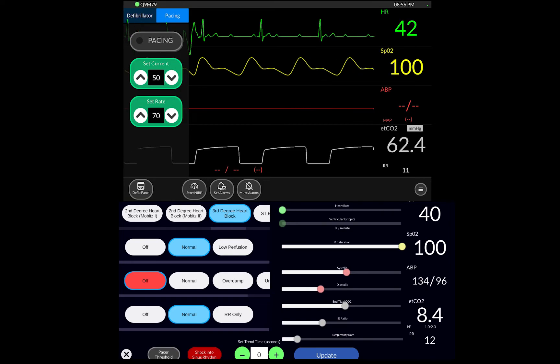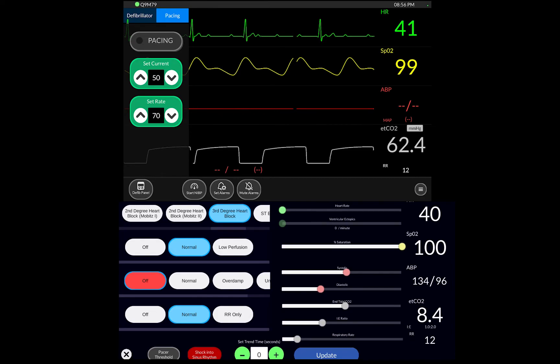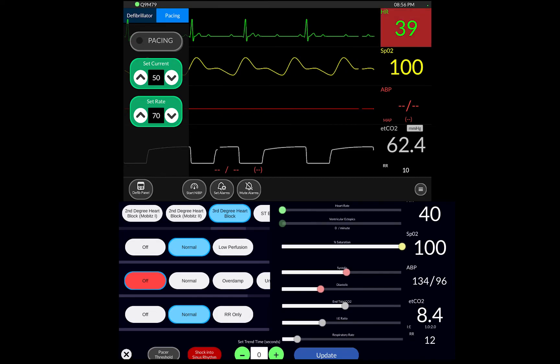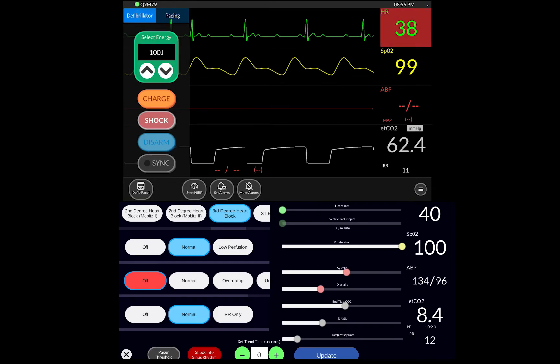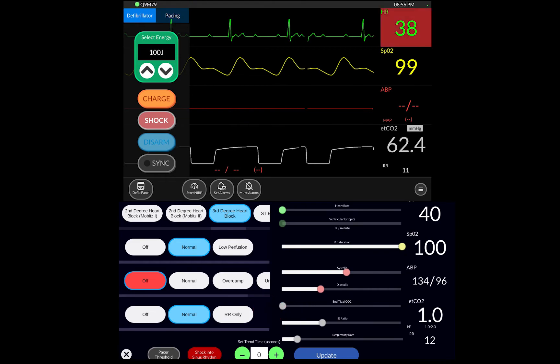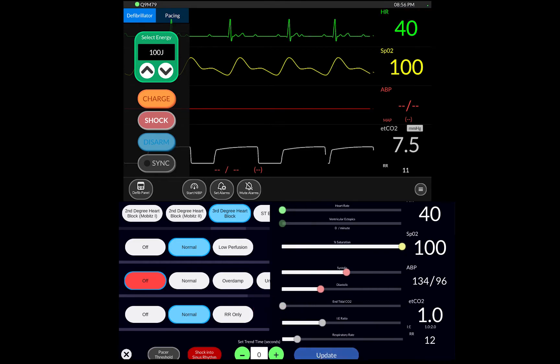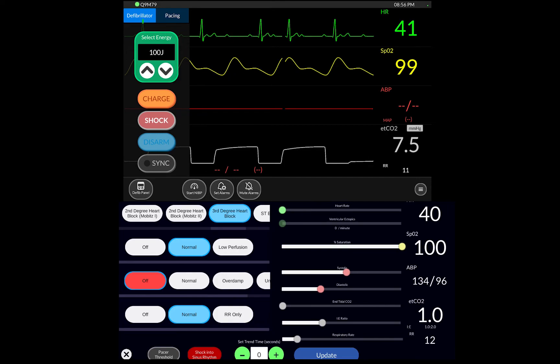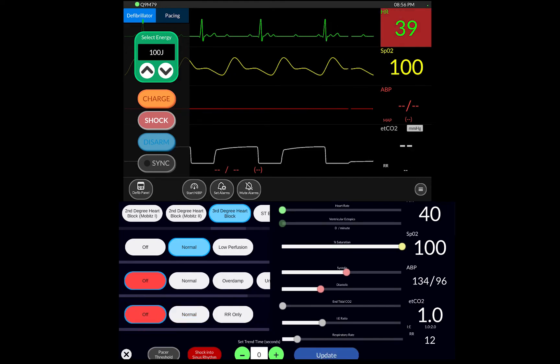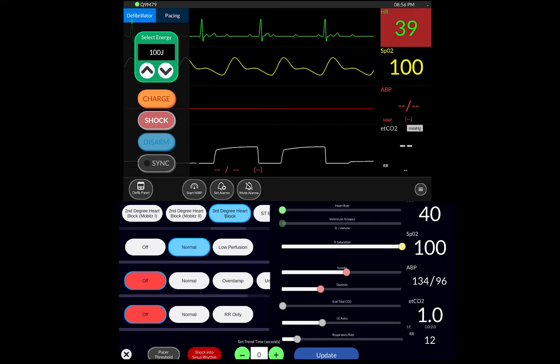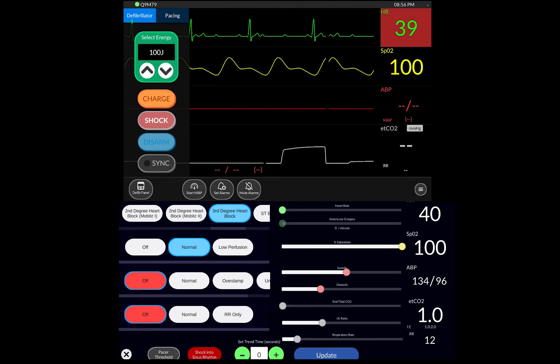The other thing to mention that I haven't mentioned is that the ETCO2 can't go to zero. So if you see there's ETCO2, if I drop it to zero, the lowest it can go to is one, which doesn't serve the purposes we always want it to serve. So if you turn it off, it then actually just flatlines at the bottom. It doesn't say naught, but it is flat. So that may show what you're wanting to show.